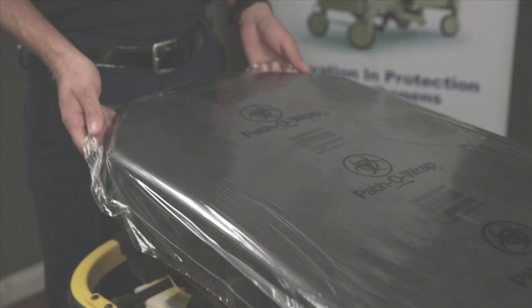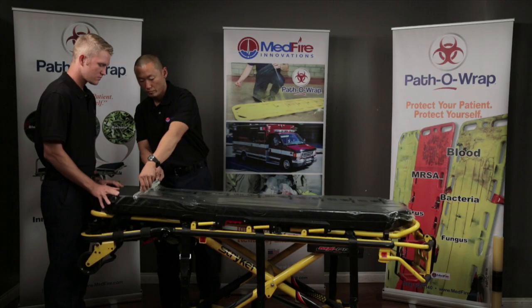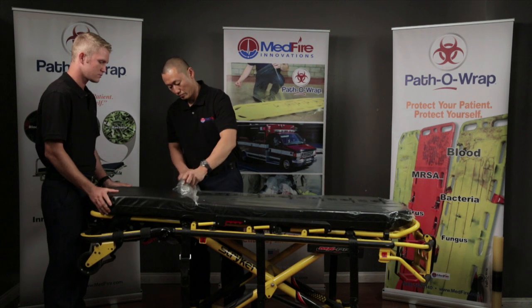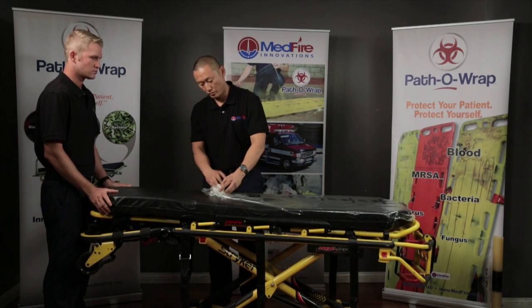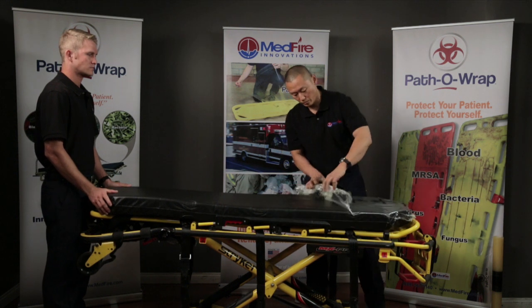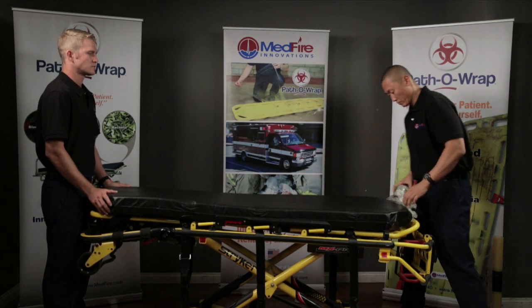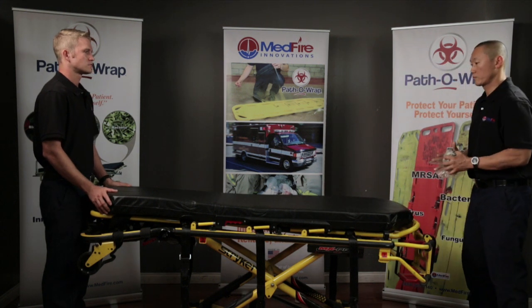To remove PathoWrap, grab and pull an edge of the PathoWrap film from the head or foot of the mattress. Start rolling the PathoWrap down and inward at the same time, making a ball, thus capturing any potential pathogens at the same time. Once the PathoWrap is fully removed after use, place the used wrap in an appropriate medical waste container for disposal.